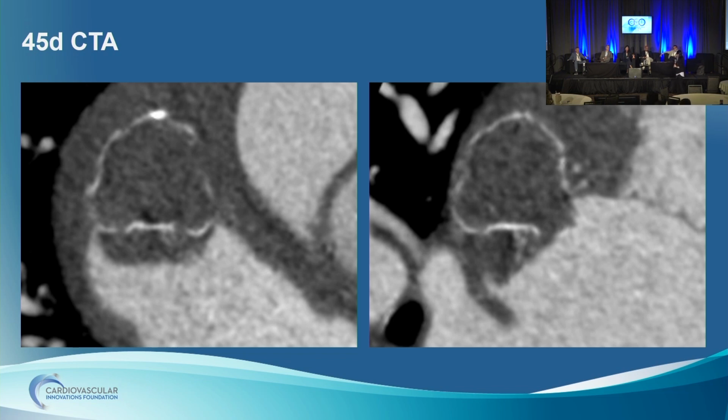Well, the good news is it's occluded. There's no leak. Bad news is it's a giant complex material in there, presumably thrombus. It would be interesting to see on TEE how mobile that was. Is it like moving around like a slinky or what? But I think your option at this point is basically to anticoagulate the patient fully. So if you're going to fully anticoagulate the patient, full dose Eliquis or warfarin therapy now?